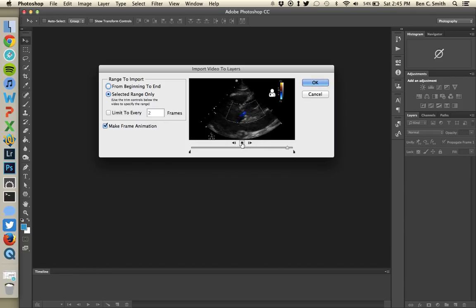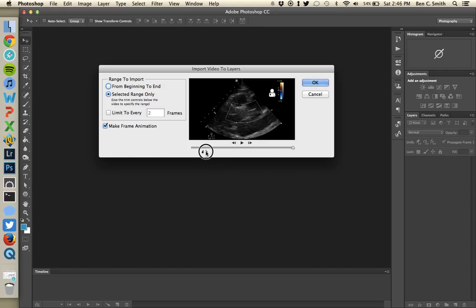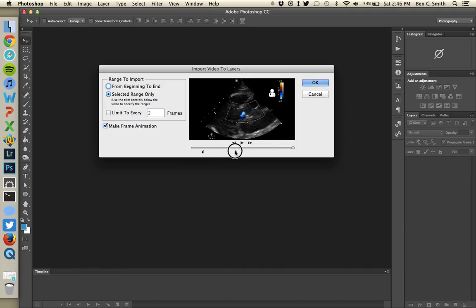You can play through the whole clip to get an idea of what it looks like and where you'd like to pull from. When looking at an ultrasound of the heart, you want to select at least two beats for your GIF, because if you just select one beat, it's going to look really obvious when it repeats. Find something repeatable in the cardiac cycle — like the opening mitral valve, or here I'm using the color flow. When the color goes away, I start there; I grab my second slider and find where two beats end, right when the color goes away again.